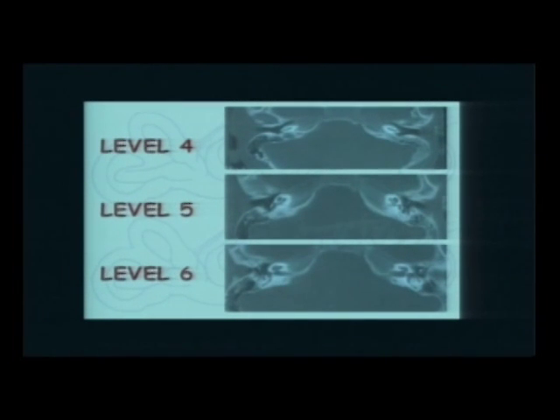This is the round window here. So when we go 1 millimeter above, this is the oval window. And this thin plate of bone here, this is the footplate of the stapes. And this is the vestibule and the posterior semicircular canal. This is the internal auditory canal. And this is the basal turn of the cochlea and the middle turn of the cochlea. Can you see this bone inside the basal turn of the cochlea?